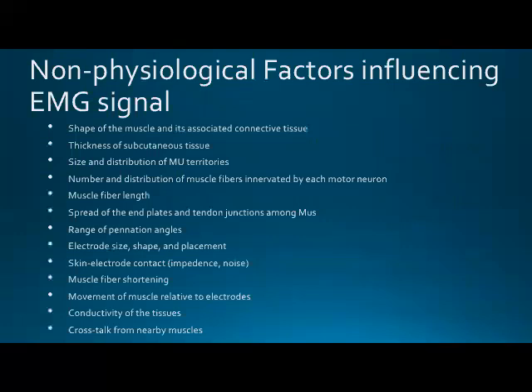It's much harder to get really clean data using surface EMG, especially outside of a laboratory setting. Most EMG studies are going to have a very high level of control. You're trying to get subject groups that are fairly consistent in training status, body weight and height, and body fat percent, so we can get rid of some of these controllable factors.